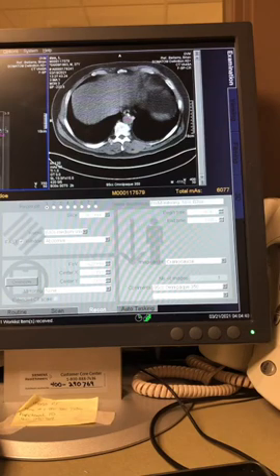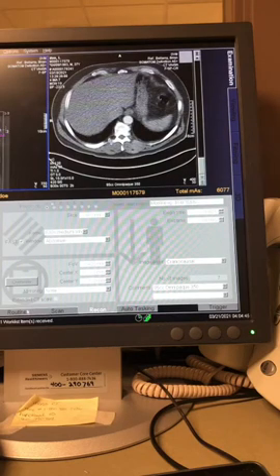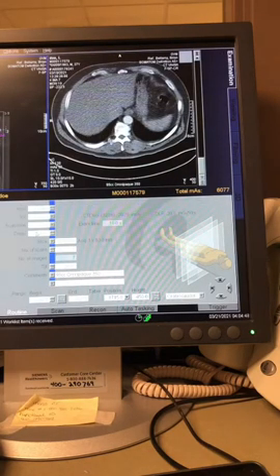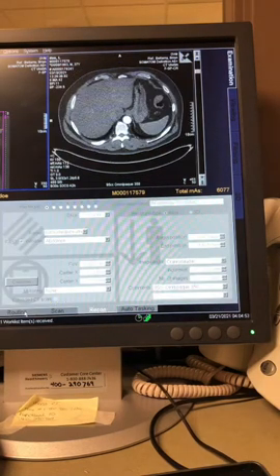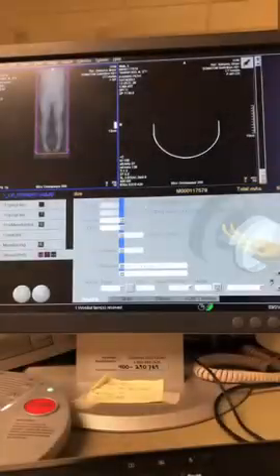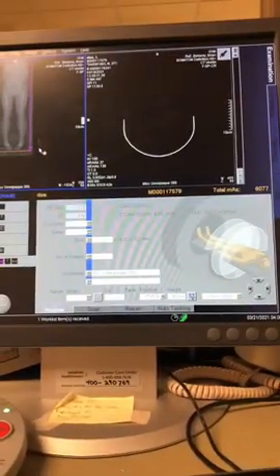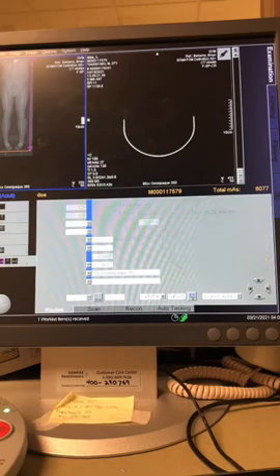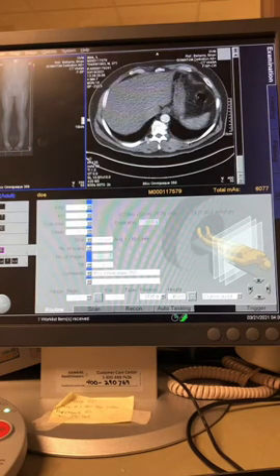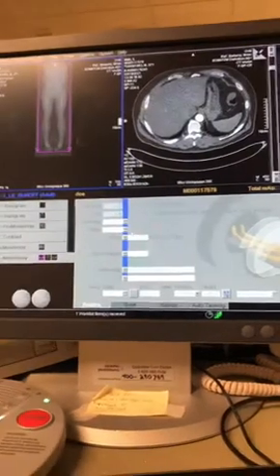So one of the combinations is the flow rate. The other part that's going to change, even with the same bolus tracking, is this tab. All right, so we're going to do a 10-second delay again. The countdown there. But this one should be faster. Oh, sorry, y'all. I freaked myself out for a second. So on the chest, I went back to check, yeah, it's 10 seconds on the monitoring. So it counts down 10 seconds after you start the scan. And then on the regular chest, it counts down another 10 after it triggers, which on that last scan put us at 23 seconds.